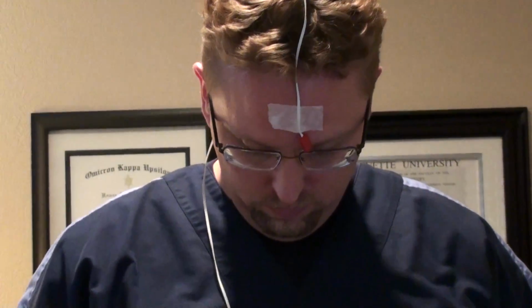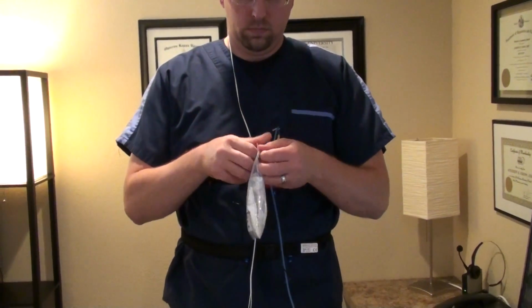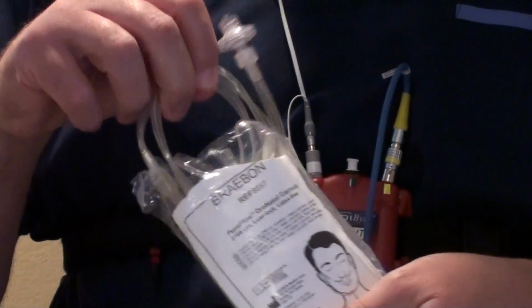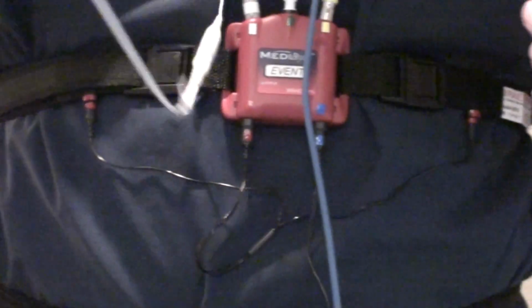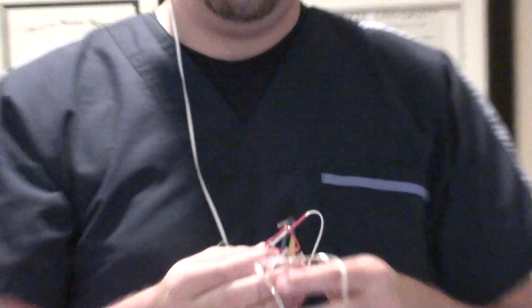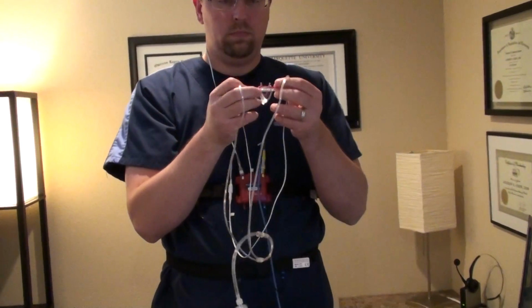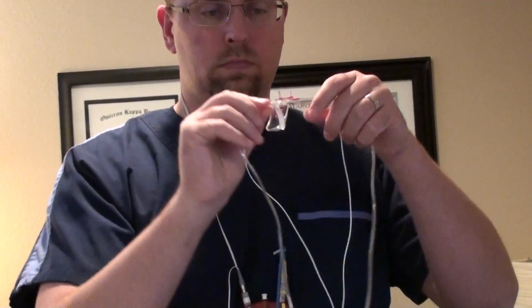Next, take the pressure cannula and thermistor, both of which measure airflow. Position the C-therm cannula thermistor onto the cannula. Position the nasal prongs into your nostrils, making sure the C-therm mouthpiece is on the inside, closest to the mouth.